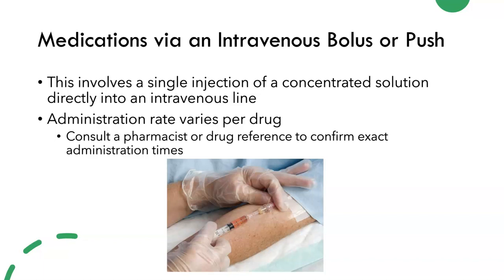It looks like maybe they're using a needle here, but more often than not, we will use a needleless device and just do it that way. The administration rate varies per drug, so this is something you want to look up before. You can consult a pharmacist or drug reference to confirm the exact administration times. So remember, your pharmacists are really, really good references for you. You can call them if you have any questions about the safety of a medication or anything at all, and they're a really great reference for you.